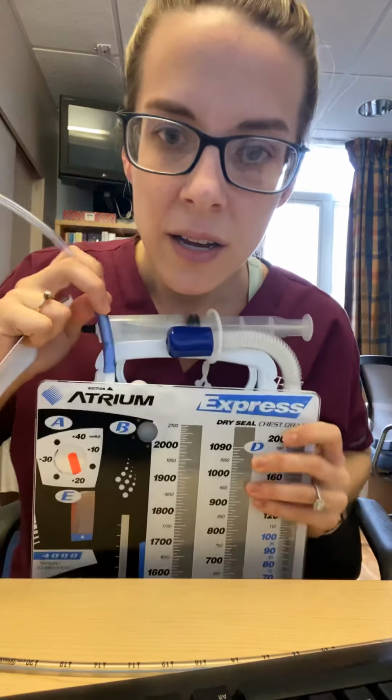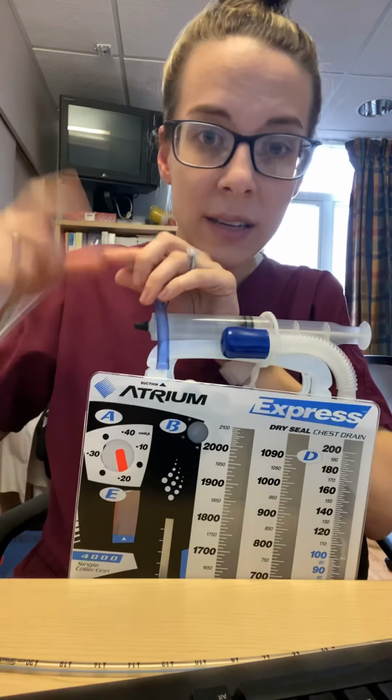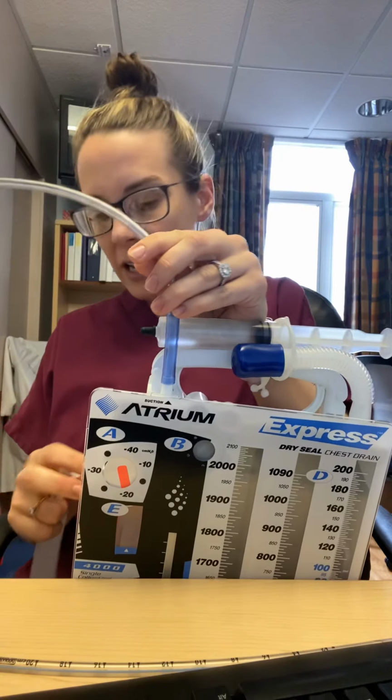So the suction, now, as long as this is connected to the wall suction, I can adjust the suction.